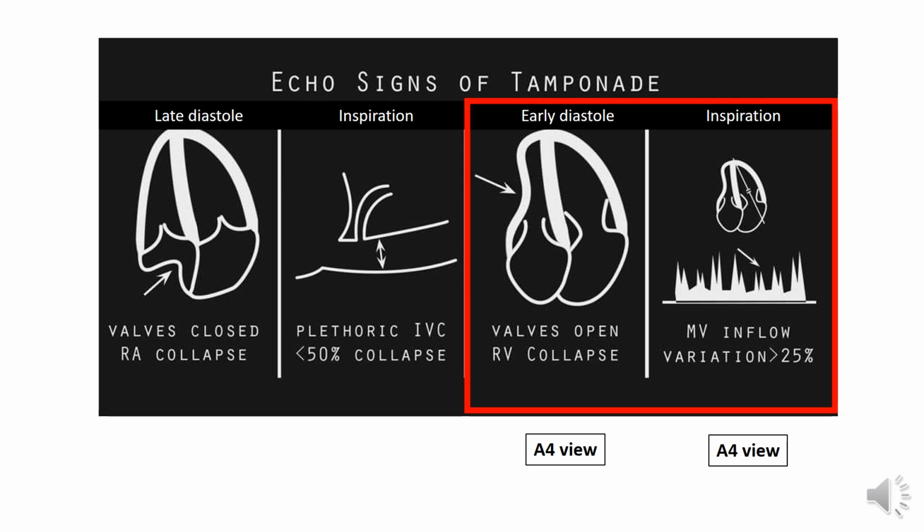So how to get these signs clinically? Clinically by measurement of what is called pulsus paradoxus. But what we can do with echo, just putting the cursor at the mitral valve opening with the pulsed wave Doppler button, we get these waves of mitral inflow with blood flowing from the left atrium towards the left ventricle.